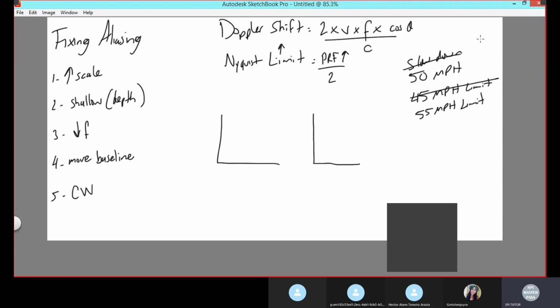All right. For number one and number two, we were increasing our limit. Our wave stayed the same velocity, but we increased our limit for number one and number two. For number three, we said, no, no, no, that's it. My limit is staying the same. We're not changing it. So let's call it 10 and 10. My limit did not change. In here, I'm aliasing, right? I'm going over my limit.